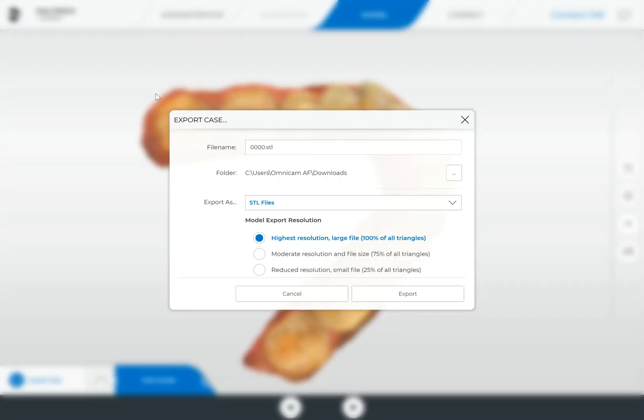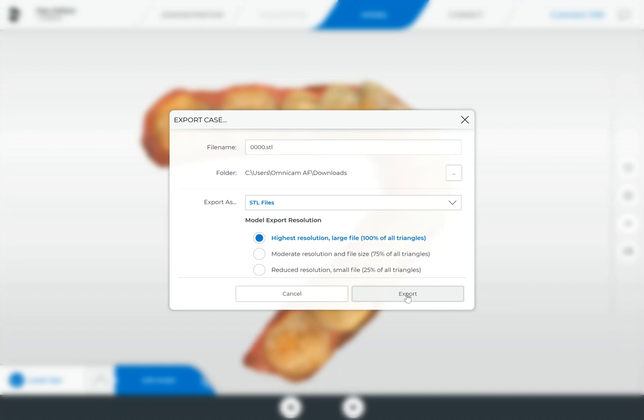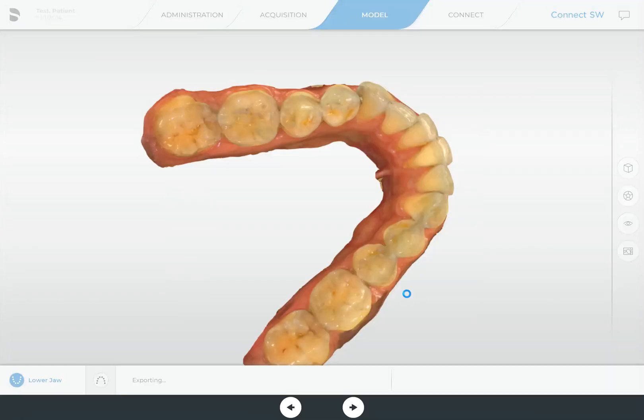Make sure the folder that you want to export these files to is selected correctly. Mine's going to the download folder, you might want to choose the desktop just to make it easy for you to find. Make sure your export as file type is STL and it is the highest resolution, feel free to change the file name if you would like, and then just click on export.